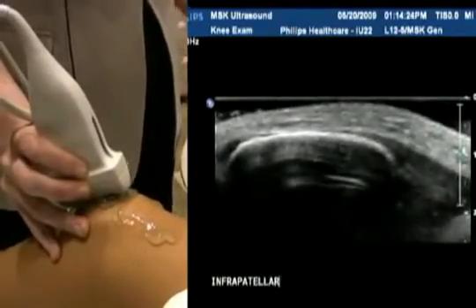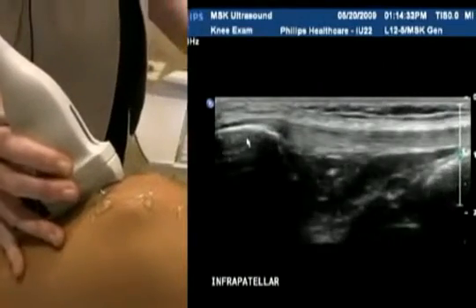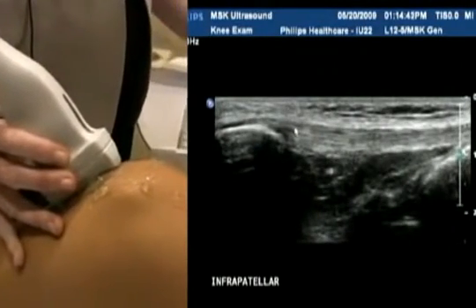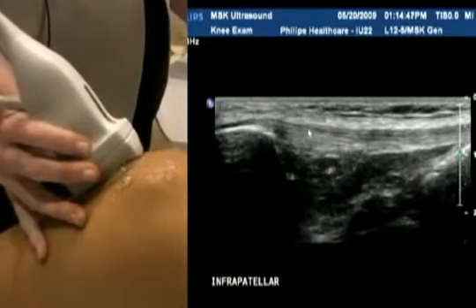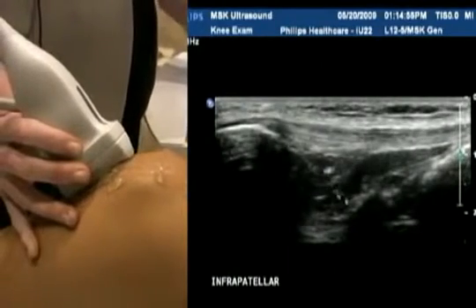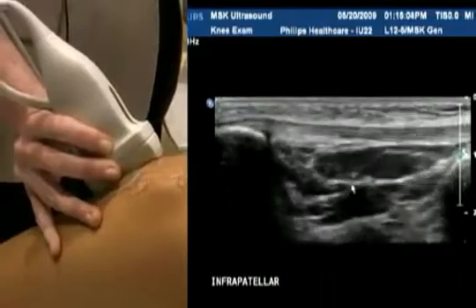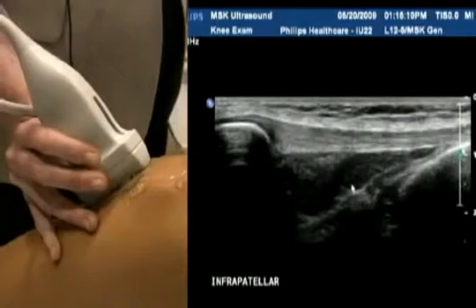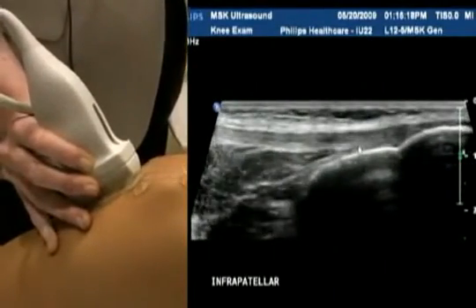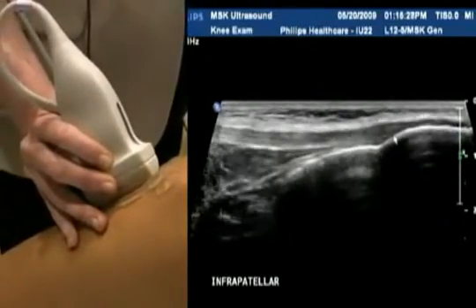On we go to the infrapatellar portion of the knee — infra obviously meaning below the patella. This is the superior portion of the patella tendon; it's a nice homogenous tendon. Some people call it the patella ligament — either is perfectly fine. The fibrillar pattern of the tendon is nice, smooth and even, with no interruption to the linear echogenic pattern. Below there's a fat pad — quite normal for it to be hypoechoic soft tissue there. Just sweep side to side, making sure you're covering the entire tendon from medial to lateral. With the 12 megahertz transducer we can almost get the entire length of the tendon. It's quite a long tendon, and at its distal attachment you can see it fans out as it attaches distally. It's really important to make sure you scan medially to laterally to cover that entire distal attachment portion.